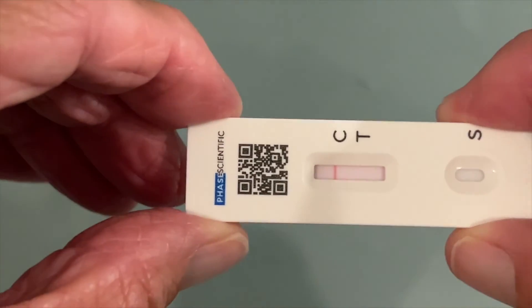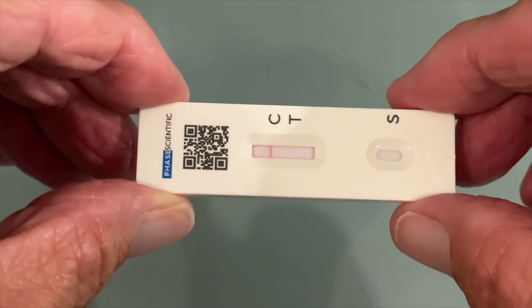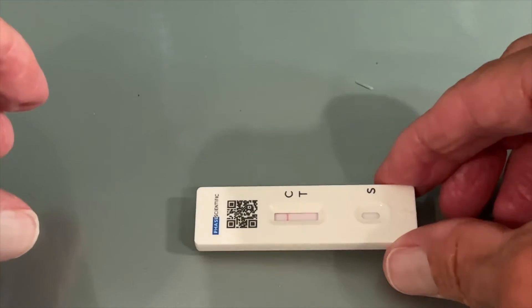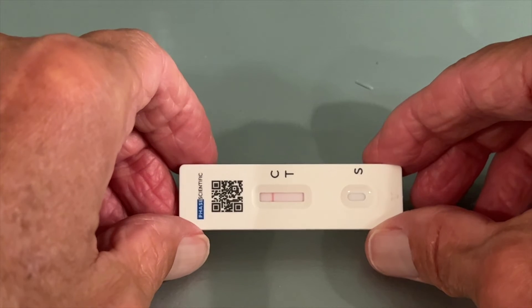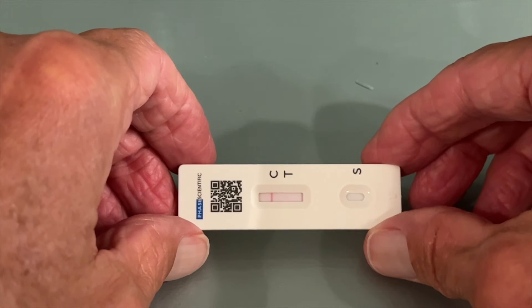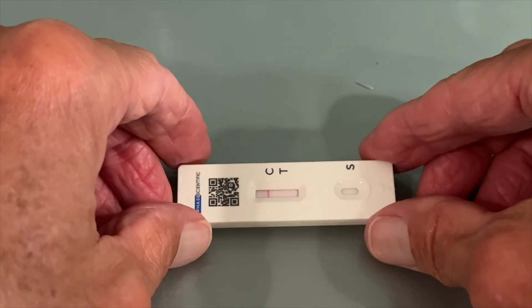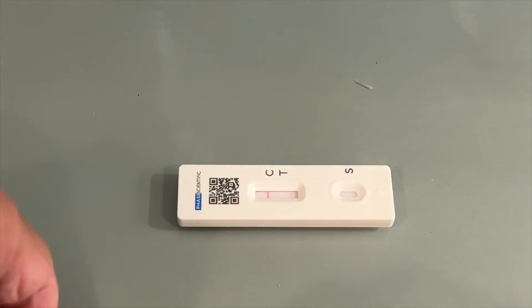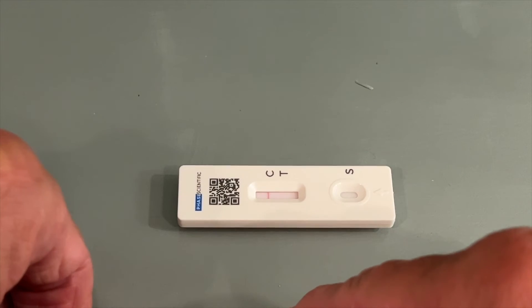All right, so it is about ten minutes in and I'm still showing negative — it doesn't look like I have it. But the thing with me is it's been over 10 days since I first developed symptoms. I still have symptoms but it's showing negative, so I don't know how reliable this is. I'd probably need a PCR test.